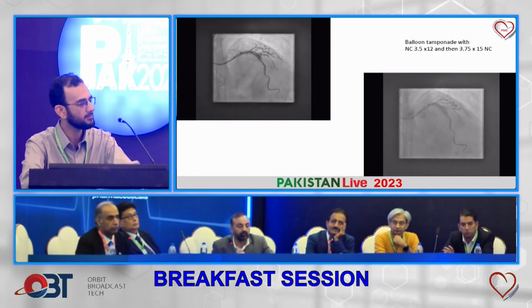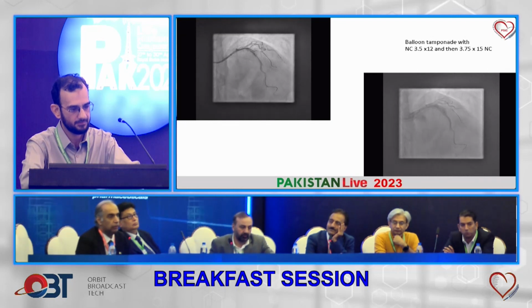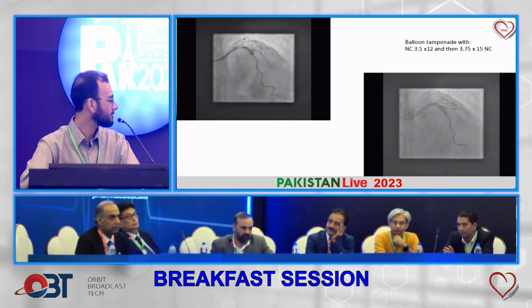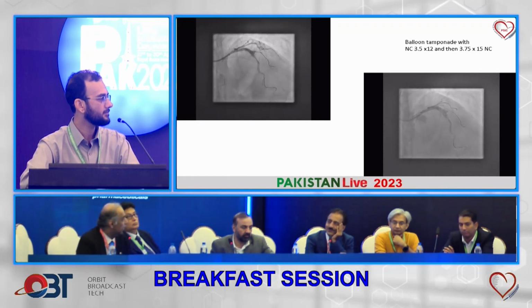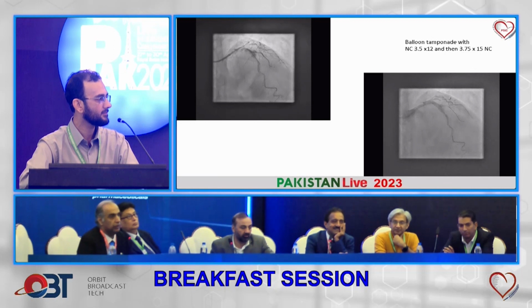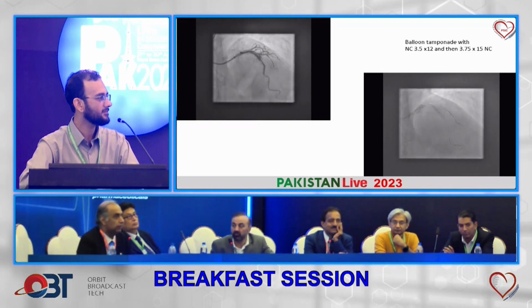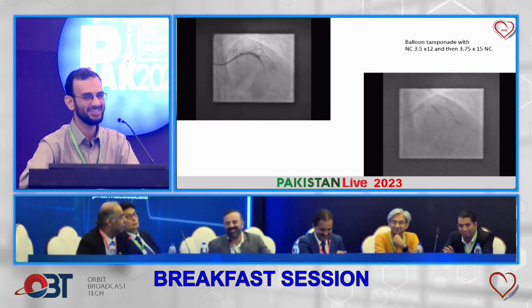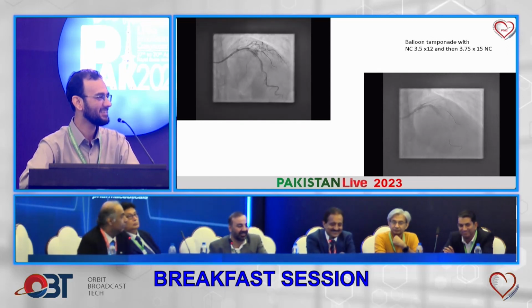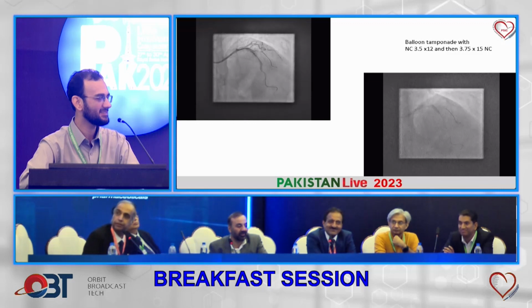Now, of course, the simplest technique over here would be to come back with a covered stent, place it over there, and sacrifice the diagonal. That's a good size diagonal, I didn't want to. But when you are talking of this good size diagonal, the question is you need to have a good size living human being and sacrifice the diagonal. The patient was luckily stable. Right, so let's see what you did.